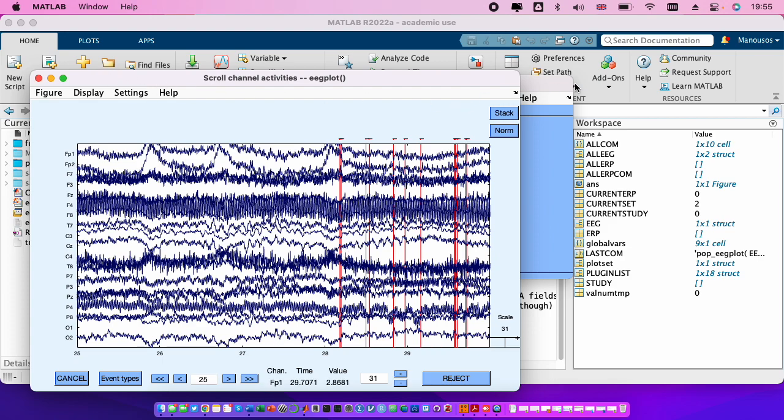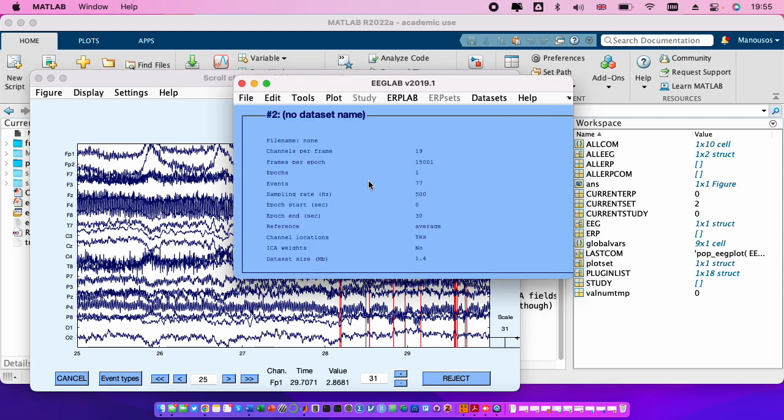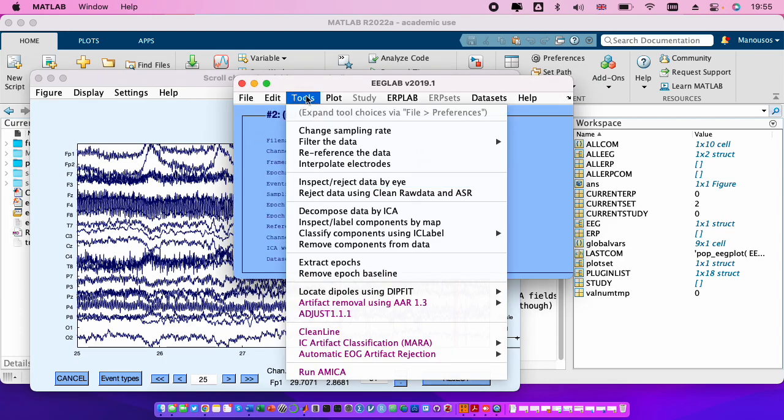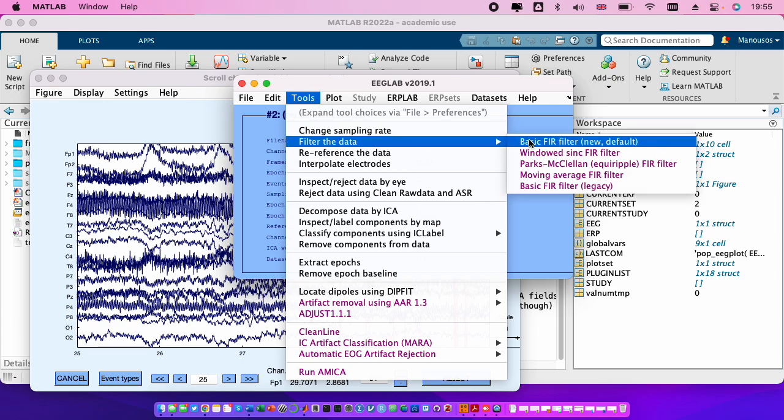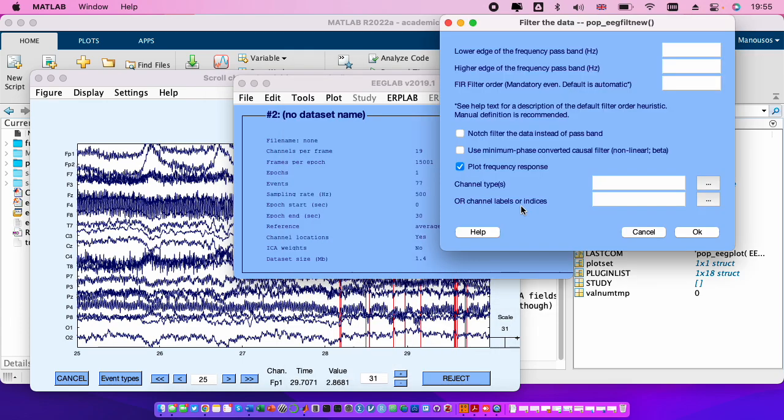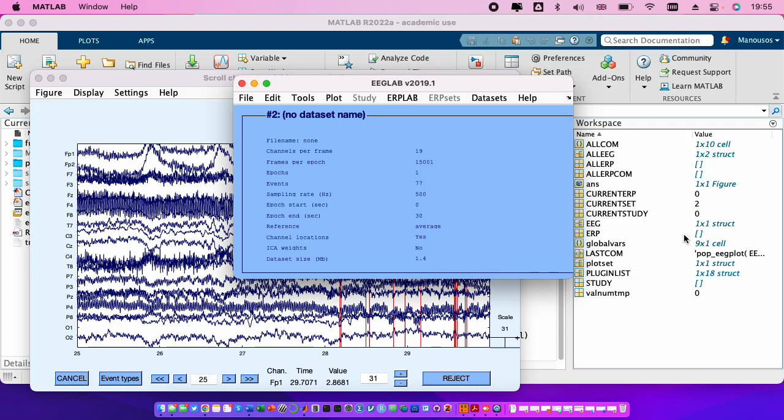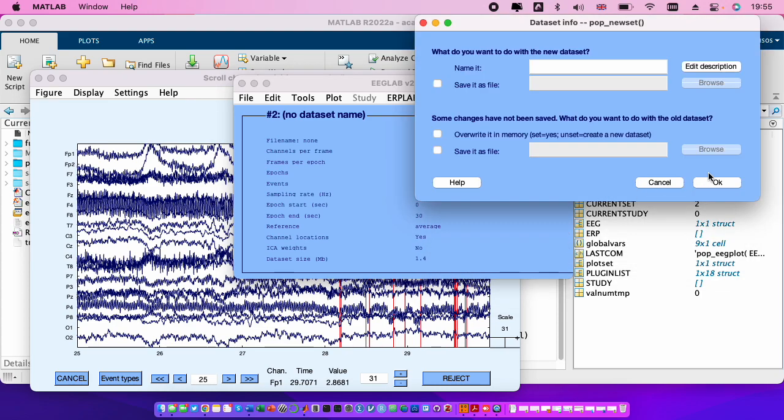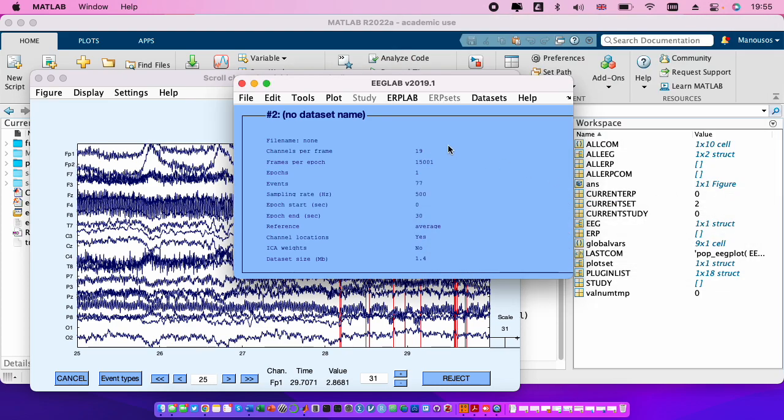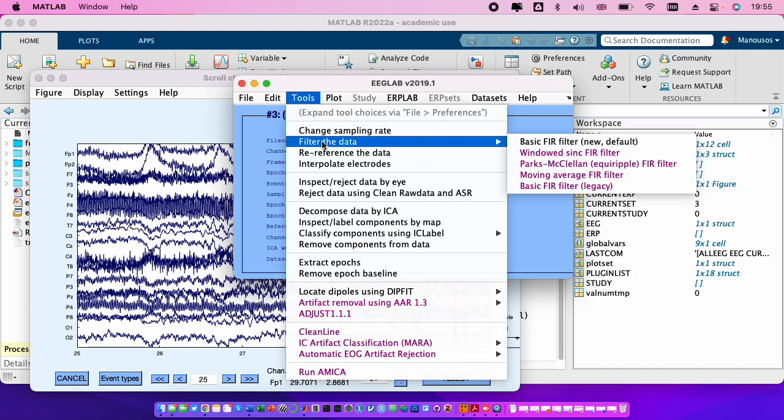So let's go first of all to filter the signals. We go to tools, filter the data, basic FIR, we put here 0.5. I uncheck the frequency response because I don't want to throw me a new window, I press ok.